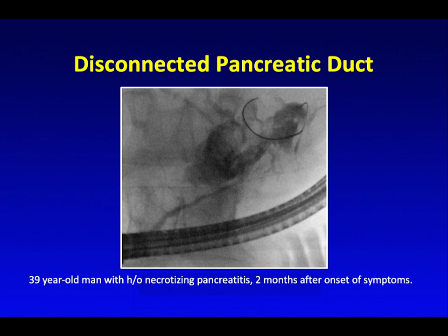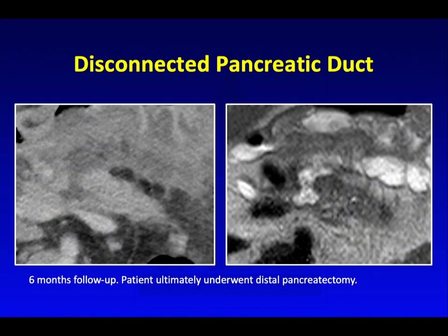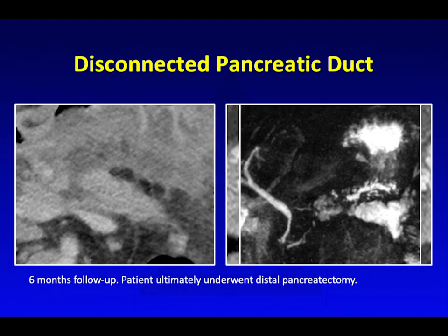On repeat ERCP, they clearly showed the pancreatic duct with abnormal extravasation of contrast material, proving a leak from the pancreatic duct. Knowing the ERCP findings made it much easier to identify the corresponding findings on both CT and MRI — specifically, this abnormal communication between the pancreatic duct and the peripancreatic fluid collection. On MRCP, you can see the pancreatic duct and its communication with the peripancreatic collection.